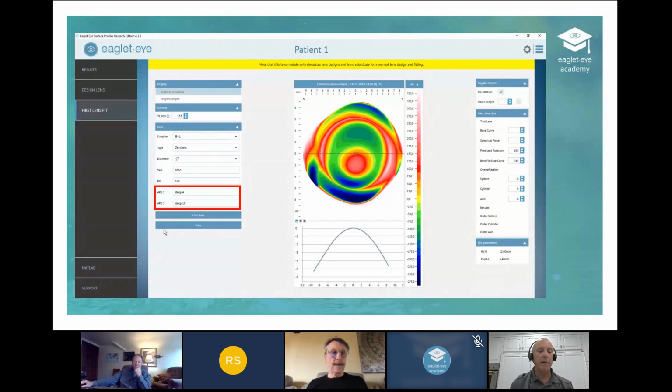And I found that it's better to go with that second lens to add that front toric or the other microvaults when we know the exact positioning of the lens. So here we've done two lenses, very quickly done, and got her to 20/25 in each eye independently, and in OU she was 20/20 vision. And it really gets us to a good place real quick. There's, I think, a couple other slides you can see.